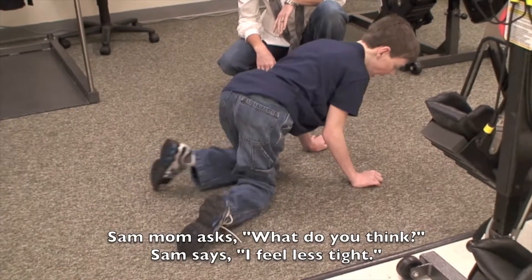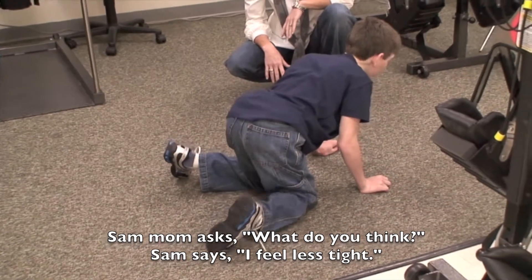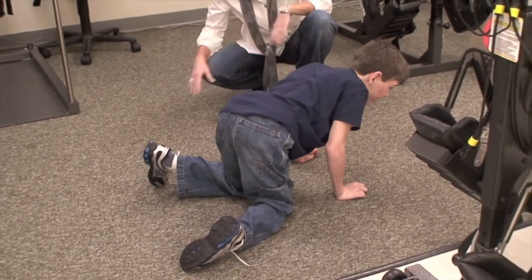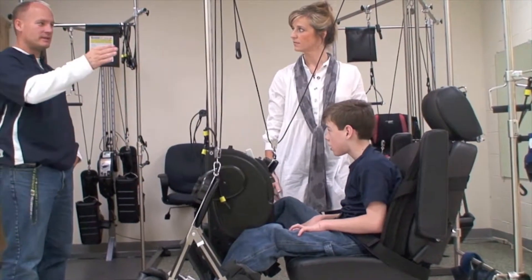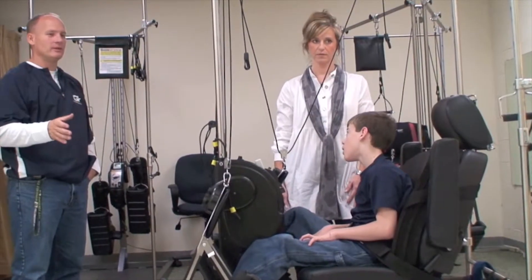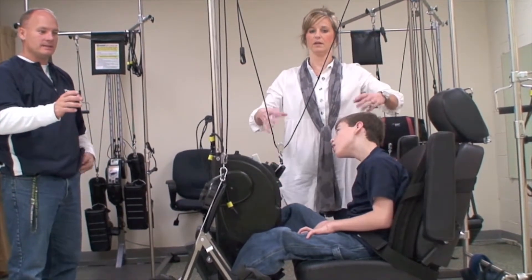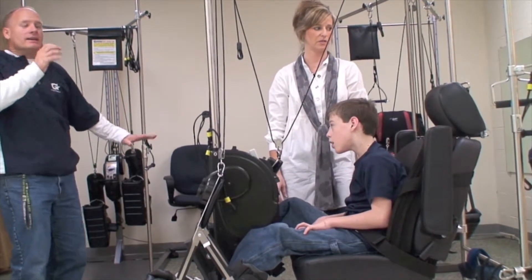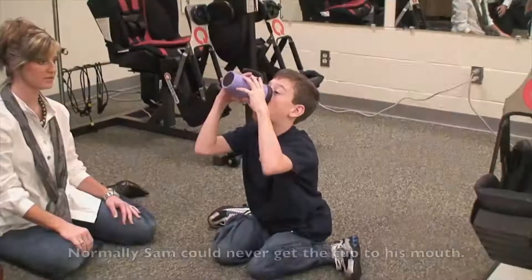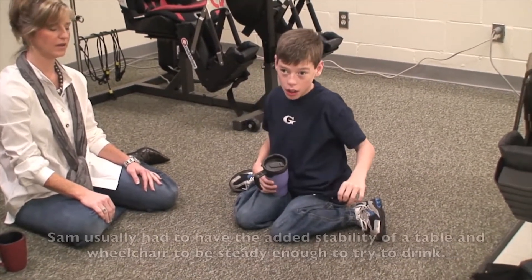What do you think? I feel less tight. Less spastic. If he was sitting at a desk grabbing a juice box or a can of cola, he can't — he has no stability here. I think you see a little bit of the shaking now, but normally he can never get it to his mouth. No way.